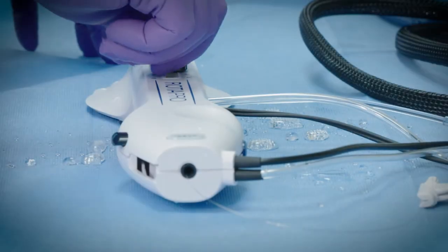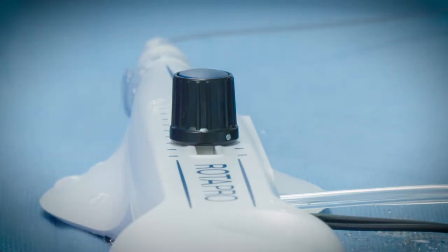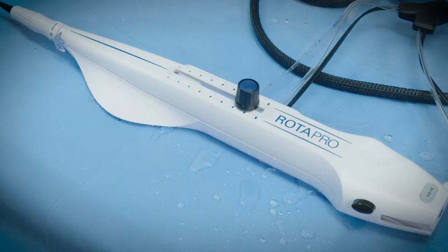Prior to inserting the burr catheter into the guide, move the advancer knob forward by approximately two to three centimeters and lock it in that position.